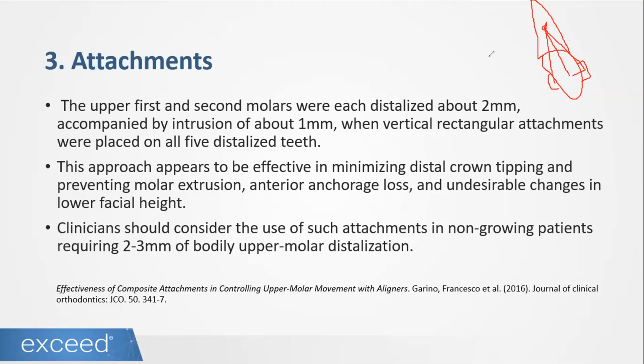So the predictability of the movement is not going to be the same, but it's also going to help you. This is something you can take into consideration for cases where maybe you have veneers. Go ahead and put an attachment in the back. But normally our software, and I think all the software in the market, calculates this with the buccal attachment.